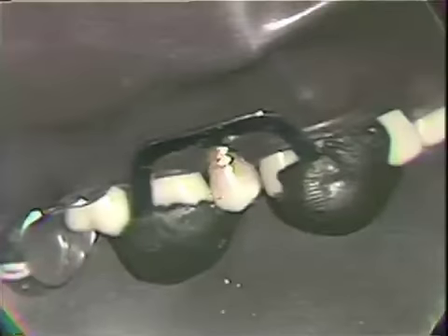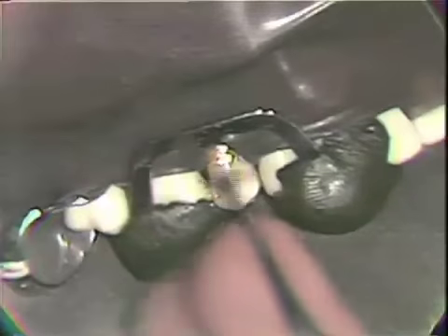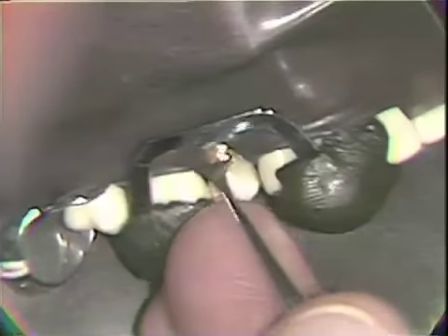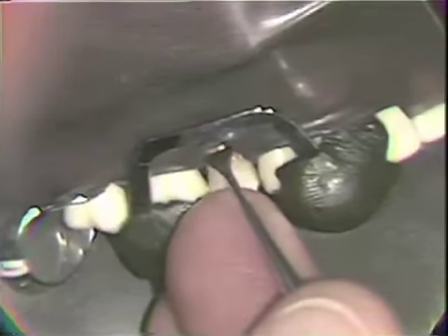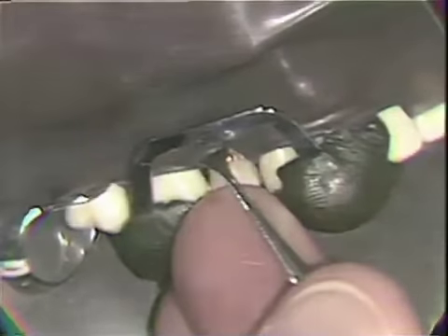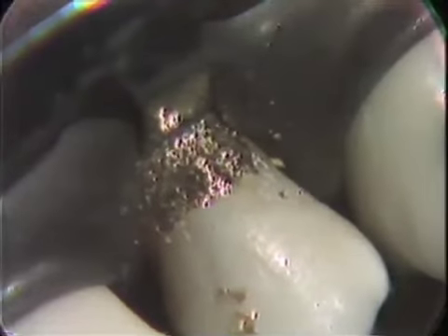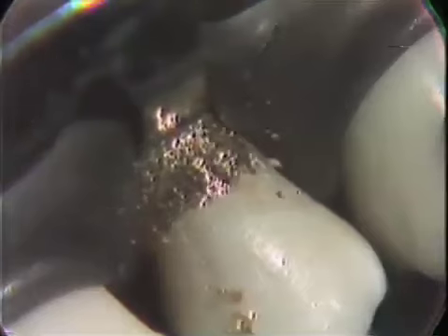Now, also in the cervical area, in order to remove the excess material, we can use perhaps the gold foil knife, and this is going to be a little large, we see, to fit into this position. So instead we'll use the Wiedelstadt chisel, which gives us a smaller size in order to carry out that contouring.